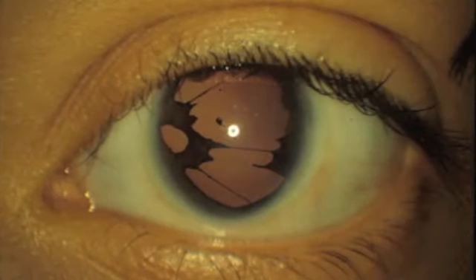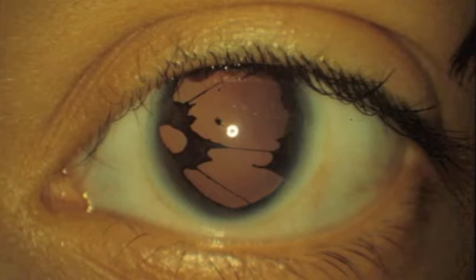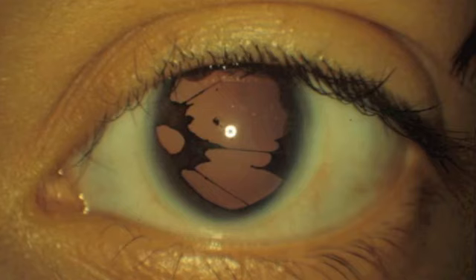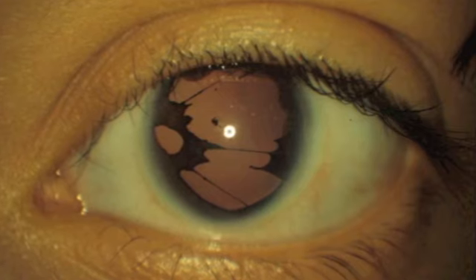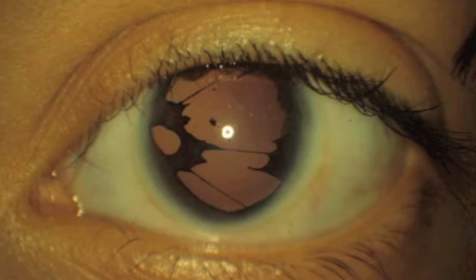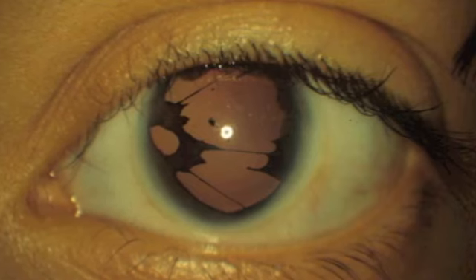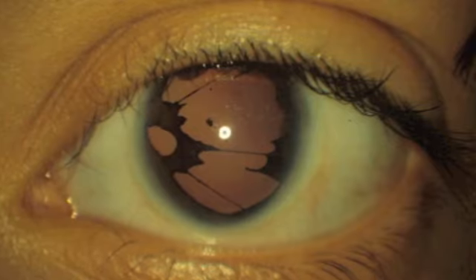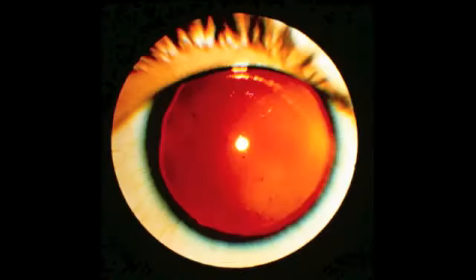Abnormalities of the pupil and iris can also be detected with the red reflex. Here we see a child with Axenfeld-Rieger spectrum, a disorder that causes a congenital abnormality of iris structure. Note the normal red reflex, which is a bit orange, behind the abnormal iris and pupil. Lastly, we have a child with no iris or pupil at all. This child has aniridia. The red reflex, however, is normal.